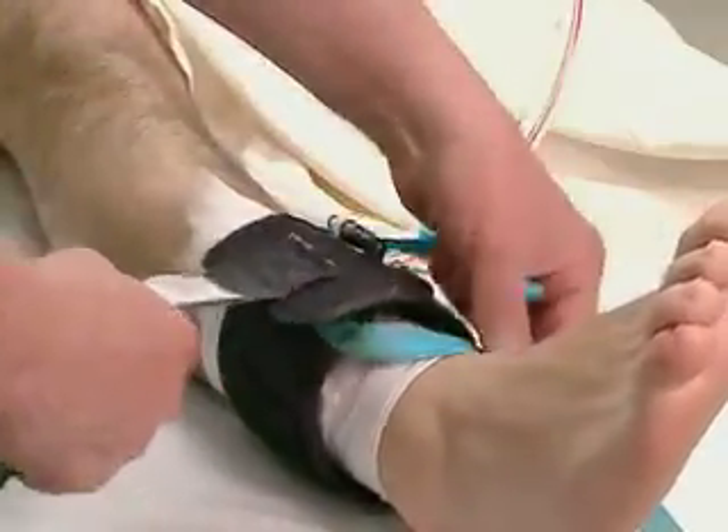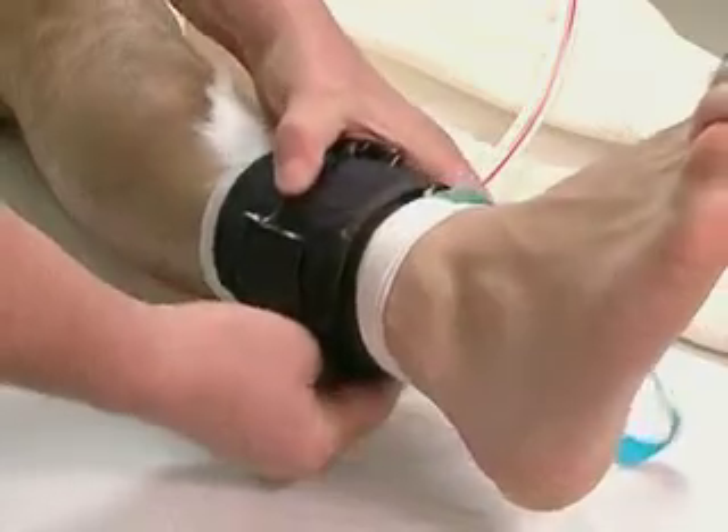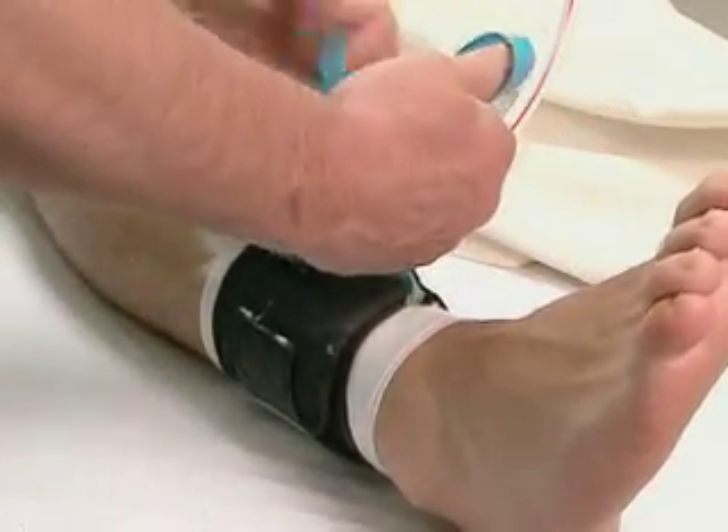Here are several precautions you can take to prevent this from happening. Be sure to select a cuff that will overlap between 3 to 6 inches when used on the patient. Too much overlap causes increased pressure and wrinkling of the underlying soft tissues.